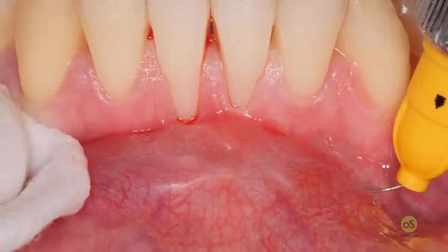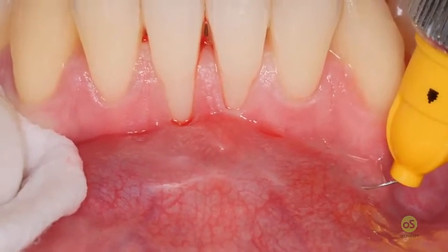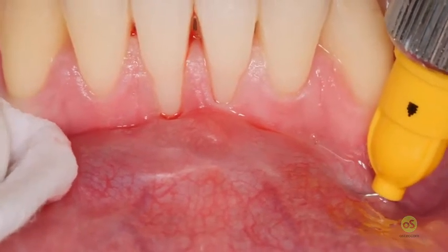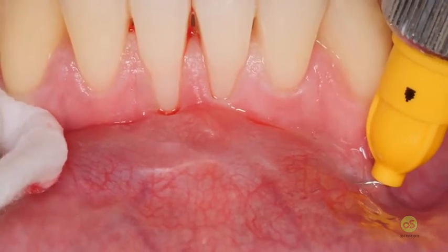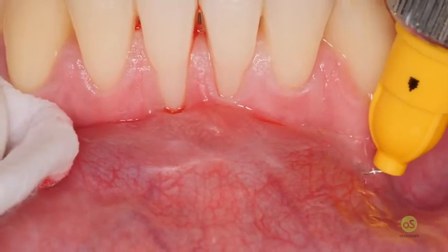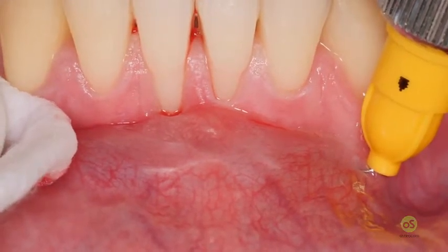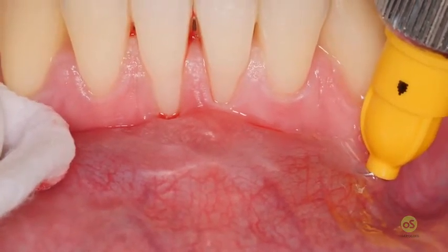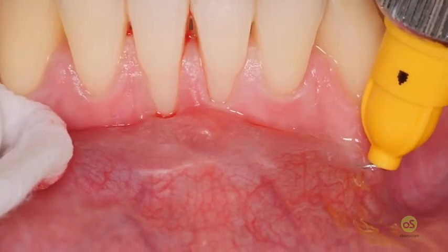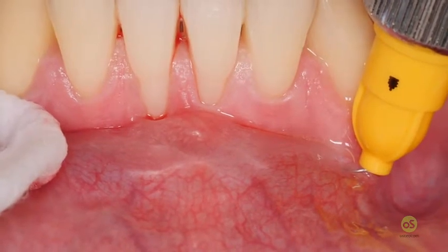It's a very complex surgery, the tissue is extremely thin, and your surgery shouldn't last more than 1 hour and 15 minutes, 1 hour and 30 minutes maximum, and so you have to save as much time as possible everywhere. And obviously during the time it takes for the liquid to spread in the lower incisors, I will take this time to perform the anesthesia in the palate.